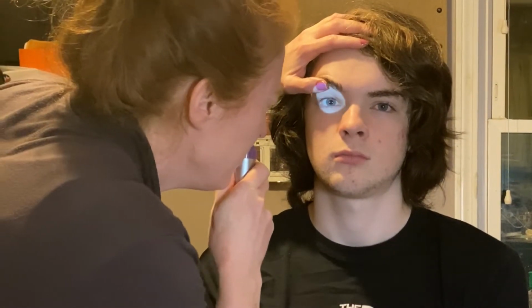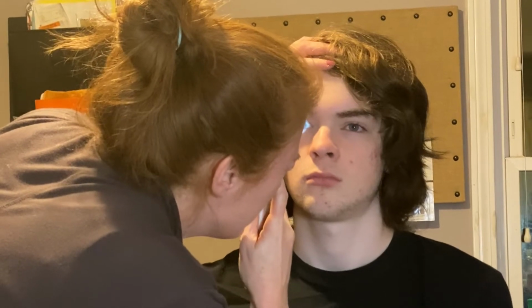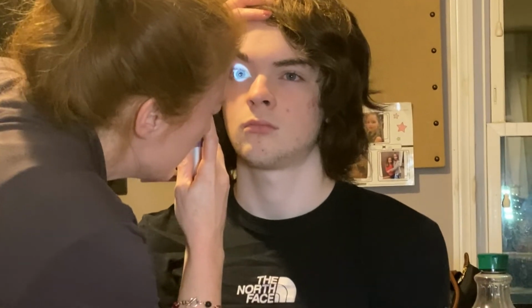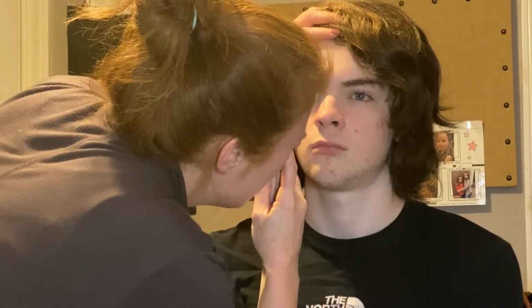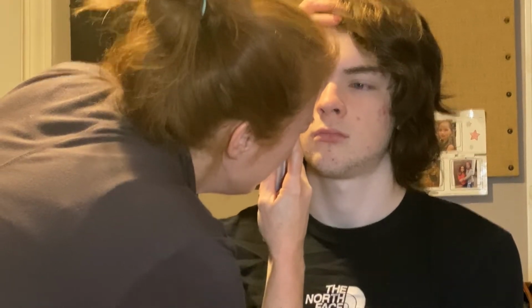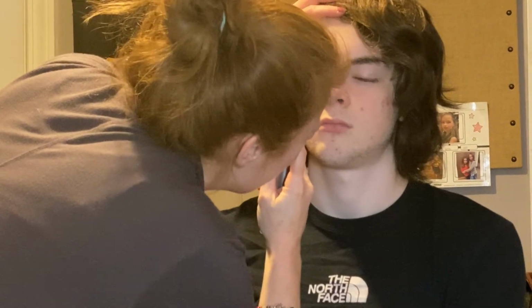First, I look for the red reflex. Perfect. All right. Your optic disc is bright, no paleness, there's no hemorrhaging. No abnormality of the cup. Arteries and veins are visualized. Perfect. Now if you can look into the light for me so I can look at your macula. Perfect. No hemorrhages or lesions noted. Going to look at your other eye.